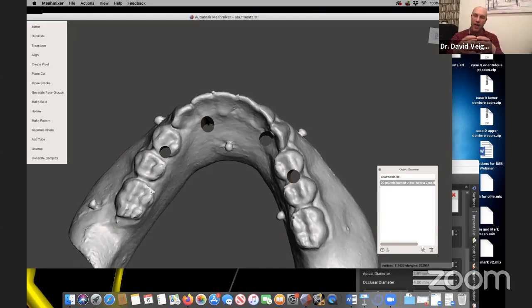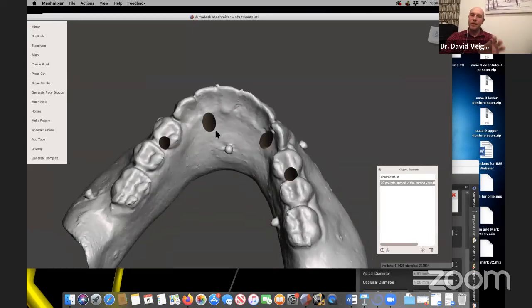That's the tolerance that I'm allowing, which means I don't have a really big thickness of resin between these. So my polymerization shrinkage is going to be far, far less compared to if I had this whole area troughed out and then I was picking them all up with a big bulk of a composite or a big bulk of acrylic, which then can shrink considerably.